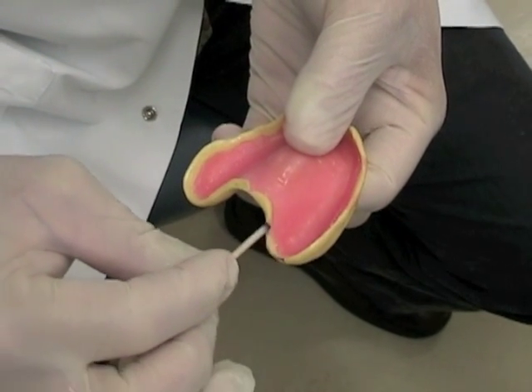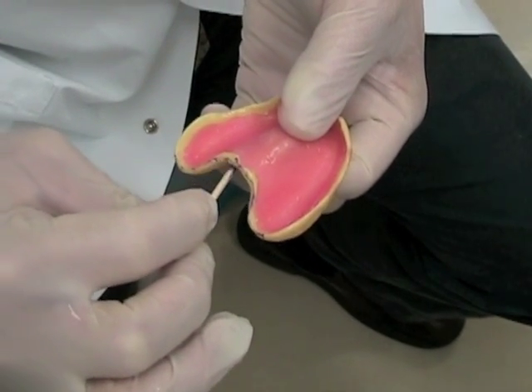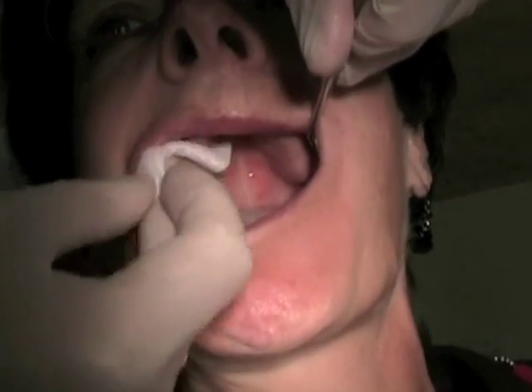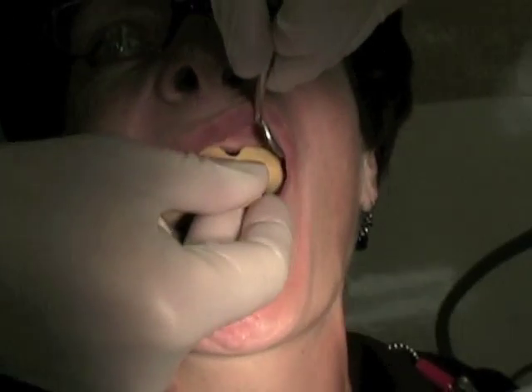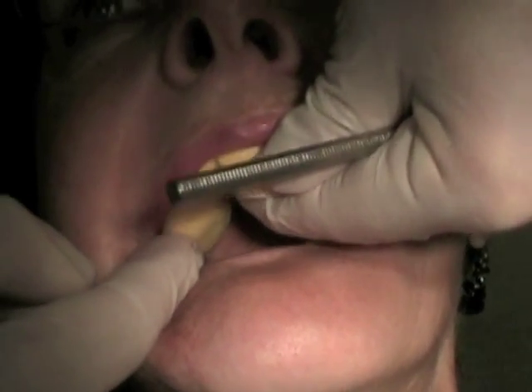The posterior border of the tray should terminate in the hamular notches and on the non-movable portion of the soft palate, the area of the vibrating line. Check your tray extension by marking the posterior edge of the tray with an indelible stick. Dry the mucosa so the indelible mark will transfer clearly, then place the tray interorally — the indelible mark will transfer to the tissue. Have the patient say 'ah'; the line should not move, and if it does, the tray is too posterior.